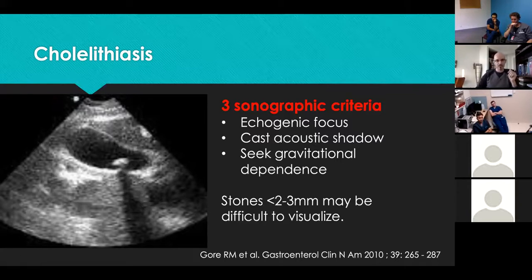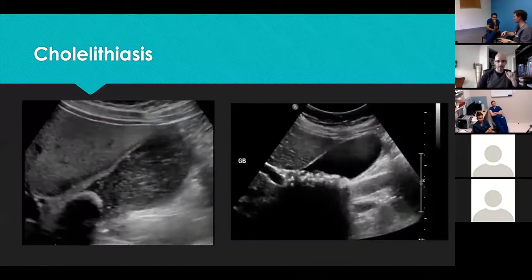And usually the stones are pretty mobile. They can be stuck in the gallbladder, but more often than not, they are mobile. Now, they can come in different shapes and sizes. They can be very big, lodged in the gallbladder. If it was a little bit smaller and lodged there, you could easily not see it, thinking that this is the gallbladder and this is the wall of the gallbladder, and it's the stone. But again, looking at the shadow of it makes it a bit more obvious.